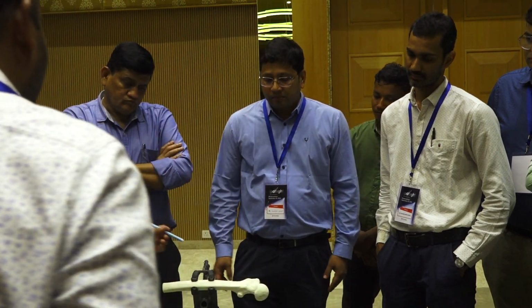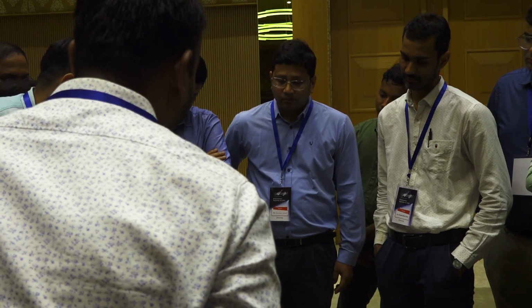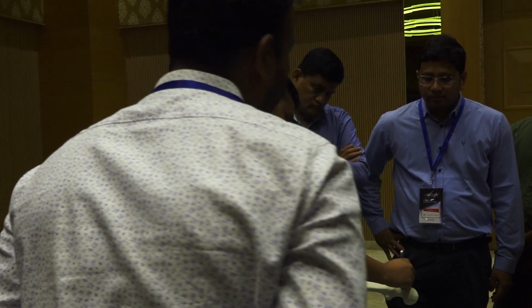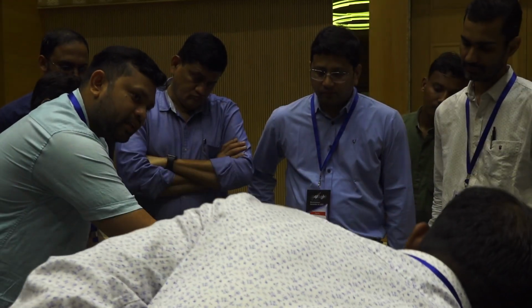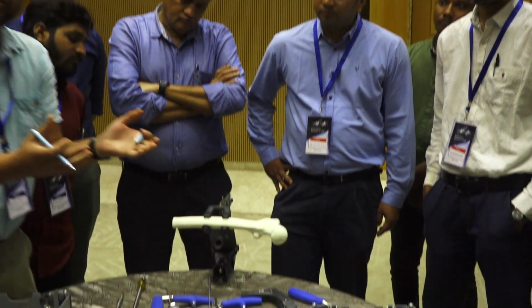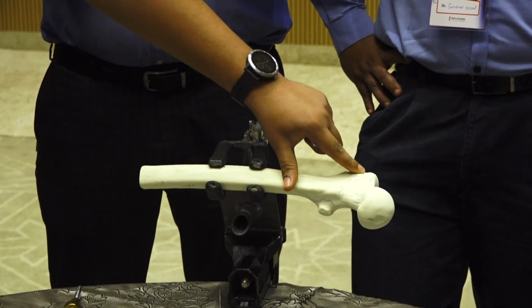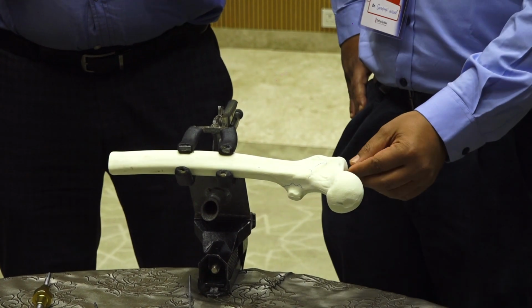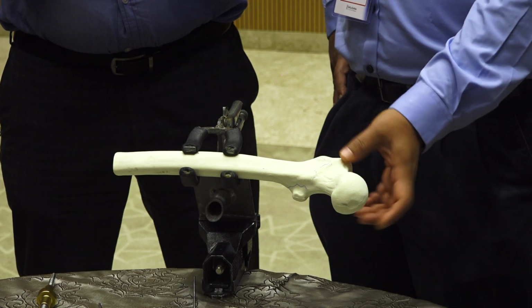One more thing, sir, as Professor Sivashankar said, if the fracture is far lateral, then sometimes the fracture is here, and you can go medial. You should go medial. Otherwise, you will not have that compression if you go through the fracture line. Point taken. If you go through the fracture, you won't achieve adequate compression.